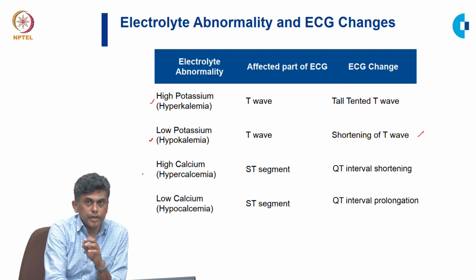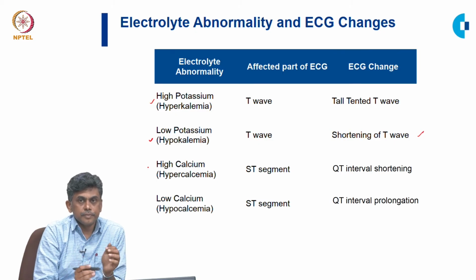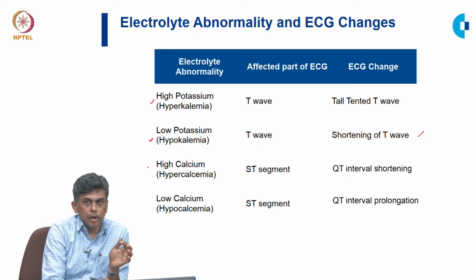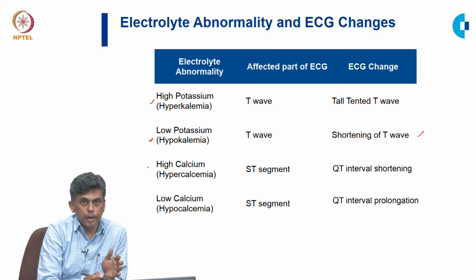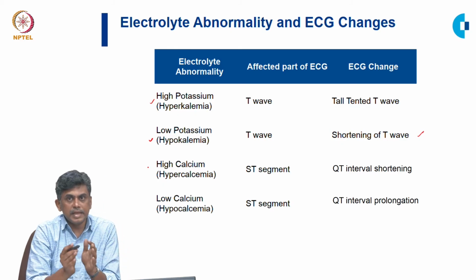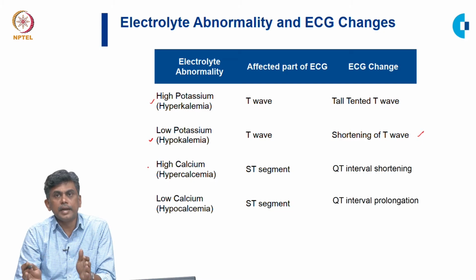Then calcium, we know calcium is going to cause abnormality with the ST segment. High calcium is medically called hypercalcemia, and low calcium is called hypocalcemia, and high calcium is going to affect the ST segment. So, when the ST segment is affected, it actually affects the QT interval.